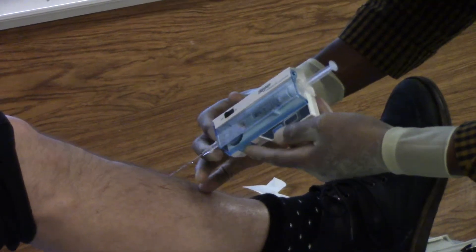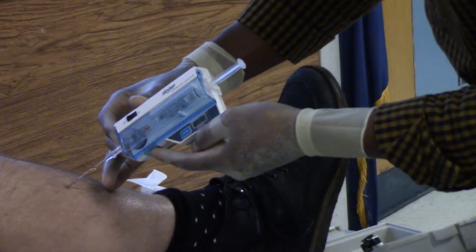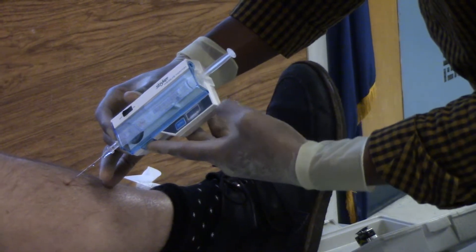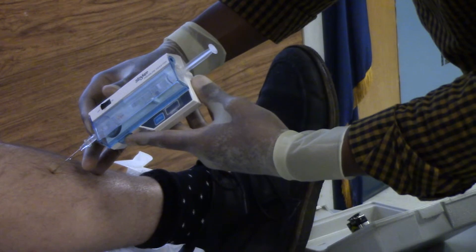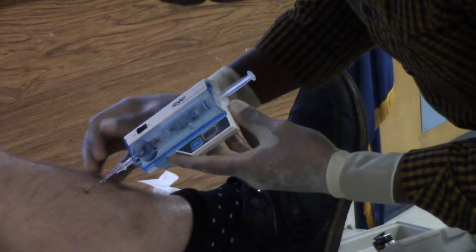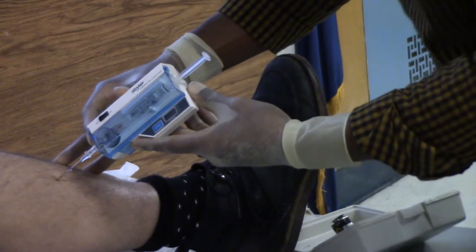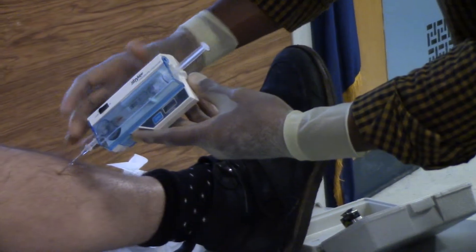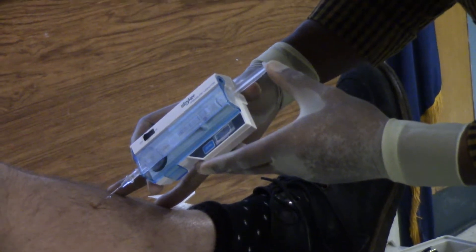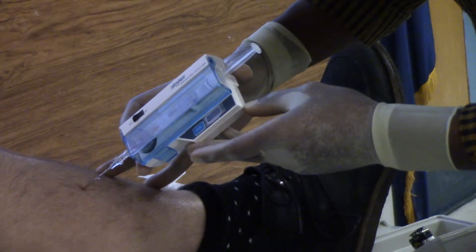You have to make contact and get to 90 degrees. You have the same energy. We zeroed — I have zero zero. All right, so go in, maybe about a centimeter. So you can really just go in about as far as it is. Now you're holding it, and you're just going to press the back part, pushing like a half CC. Reading is now 37.